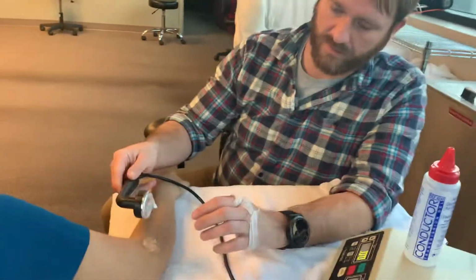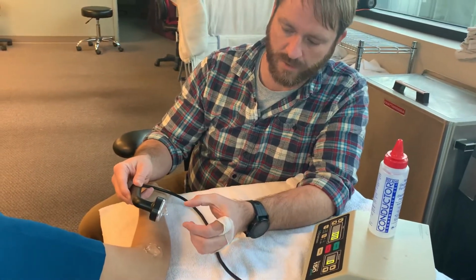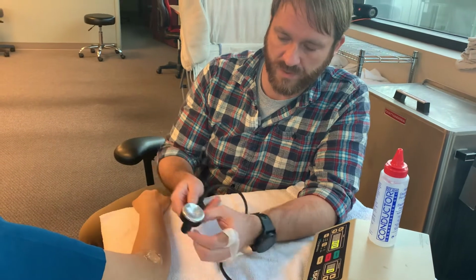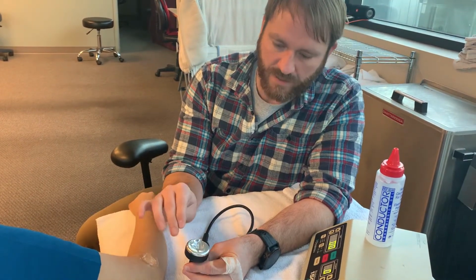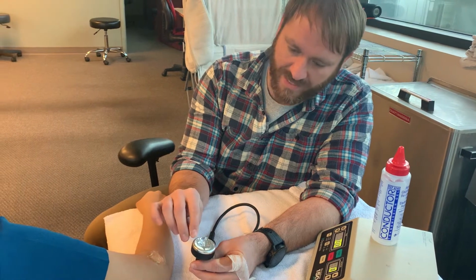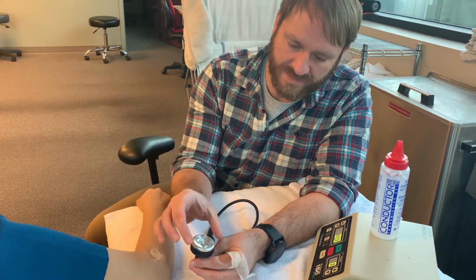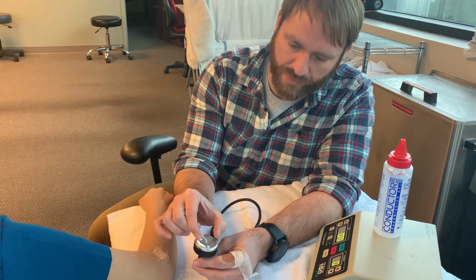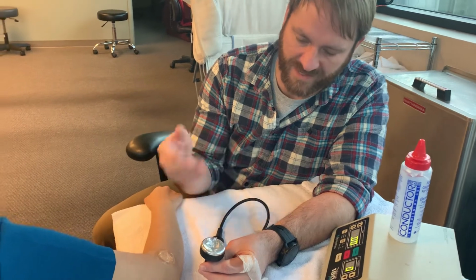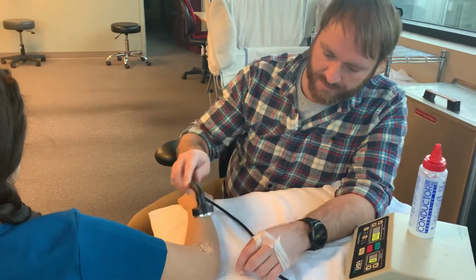Now there are ultrasound heads or transducers that are a little bit smaller. One thing I should mention before we start this is that the effective radiating area of this transducer head isn't the complete head. So we're not getting sound waves through the entire transducer here. It's really the middle third of this that's getting the most, or the spike in the ultrasound activity. So that's where it's going to be the most effective.